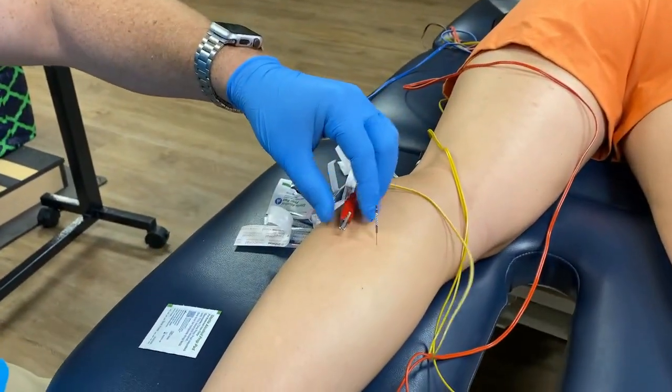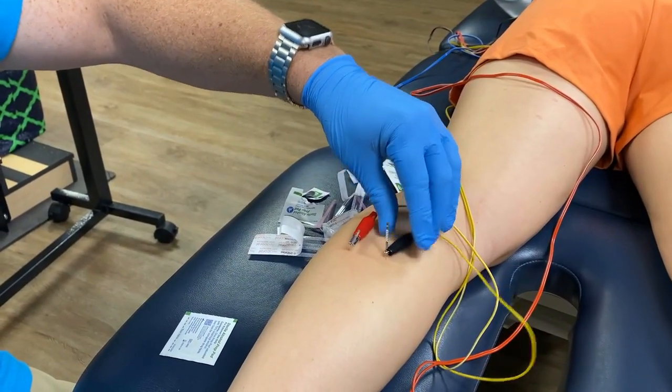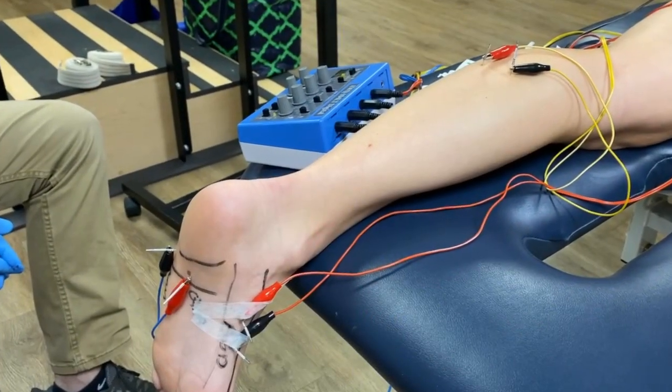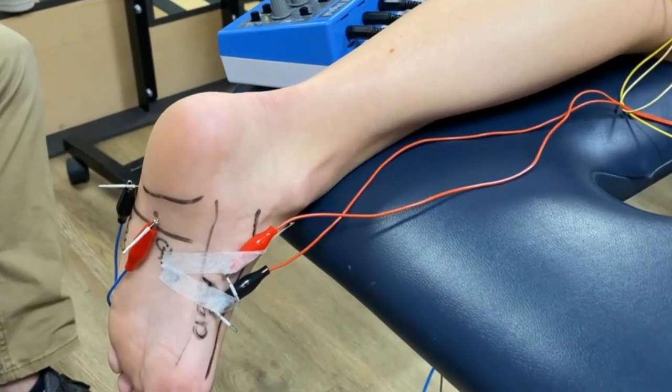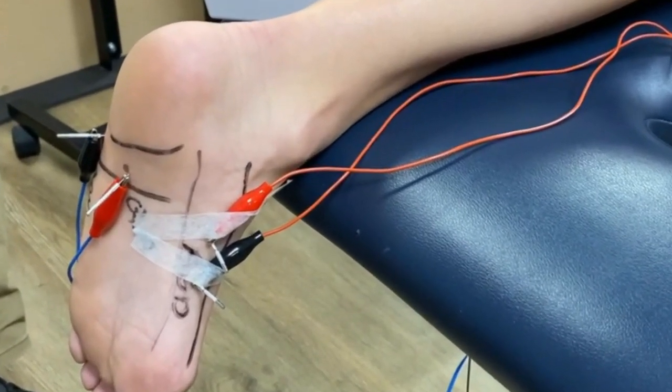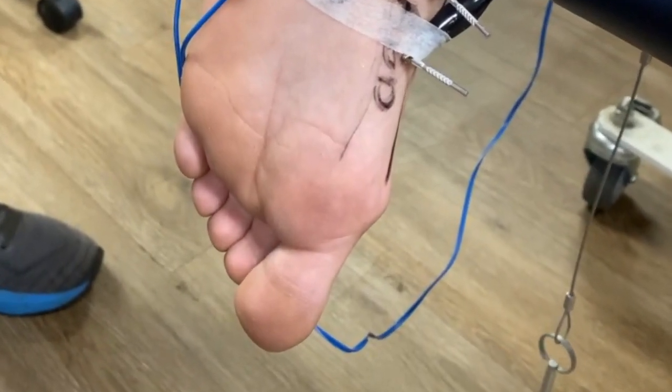Your last electrical stimulation channel will go on the medial and lateral heads of the gastroc. For this treatment setup, we typically run the electrical stimulation 10 to 15 minutes at a continuous wave frequency with intensity set to the patient's tolerance. You can see the abductor hallucis abducting the great toe with electrical stimulation.